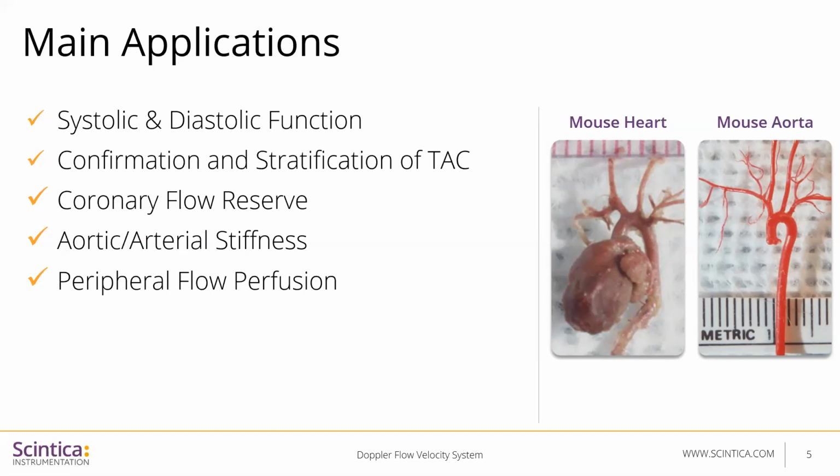Okay, so at this point, I'm going to have Scintica turn on the camera so that we can watch Sydney do the preparation. She's just setting up the animal on the surgical monitor system. So she started first by anesthetizing the animal. We are using isoflurane here with an oxygen tank. She's secured the animal onto the surgical platform. So again, the platform is heated.